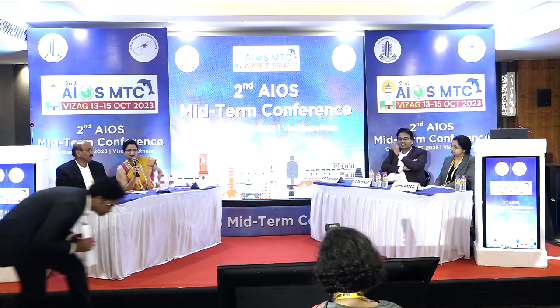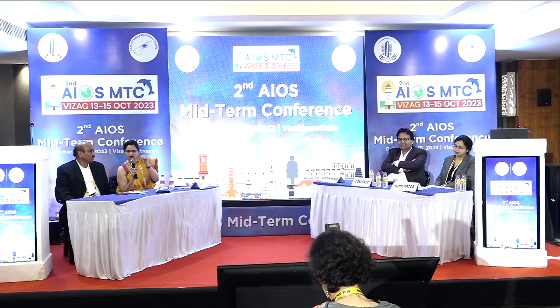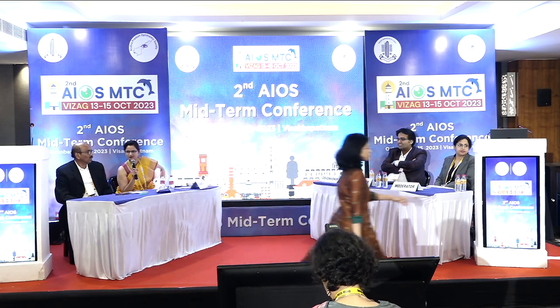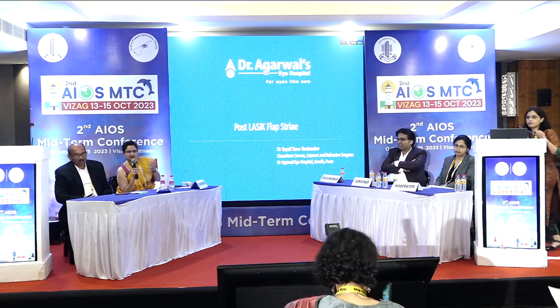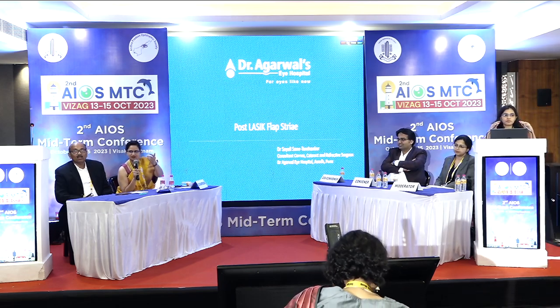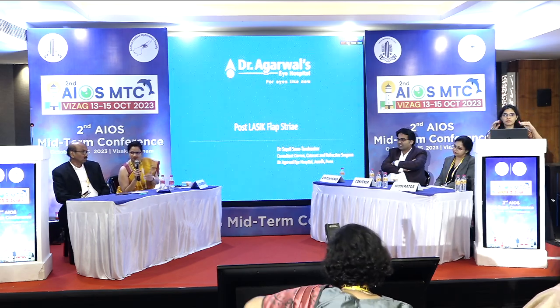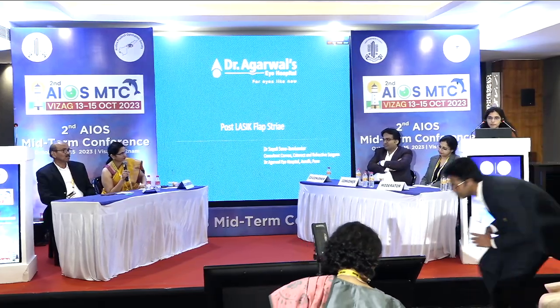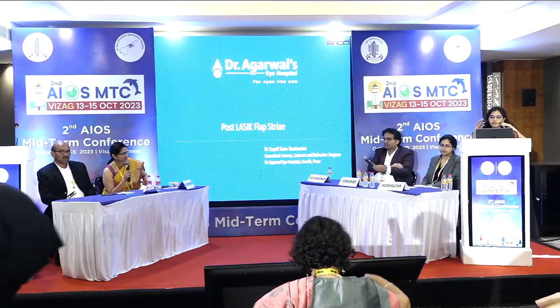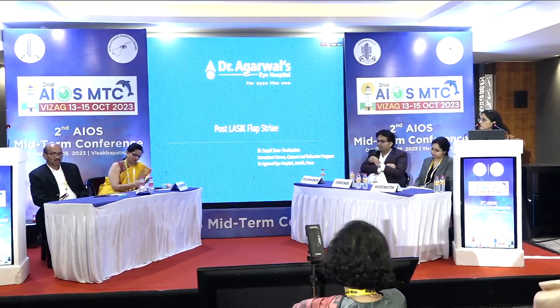For the youngsters who are just starting off PRK, a single drop of NSAID before putting the BCL helps in tackling the pain. Also stick to the instruments that are given in fellowship. A hockey stick really helps to take off the epithelium safely, or using a well really helps in maintaining the contact time. So stick to the instruments, they are very important in the learning phase at least. If the well doesn't touch the conjunctiva, the pain will not be there.